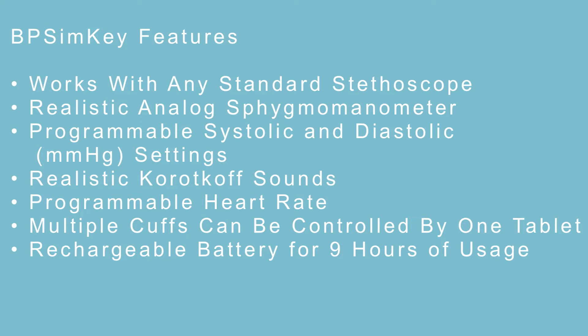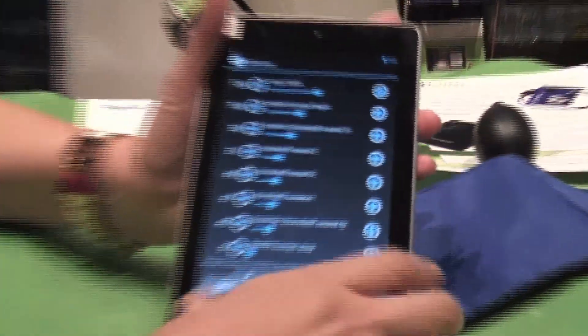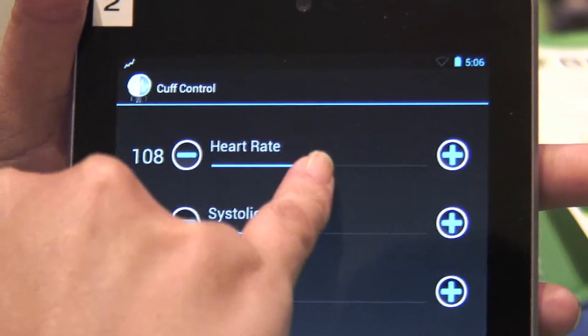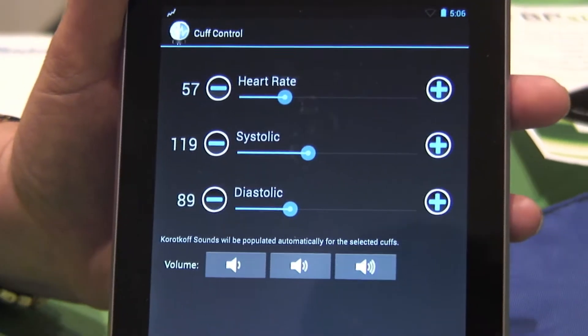You can also use a real everyday stethoscope to listen with it. It has two basic settings and it runs with a tablet. Your first setting lets you slide and change your heart rate, systolic pressure, and diastolic.